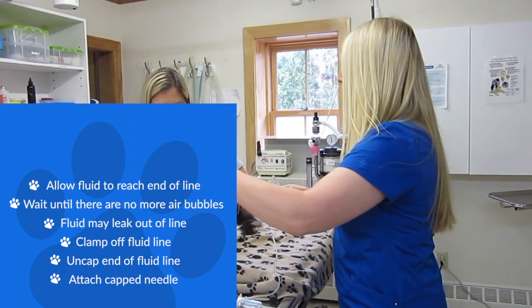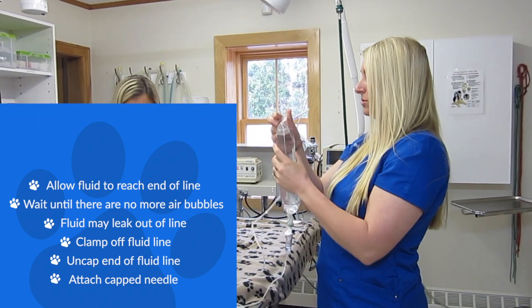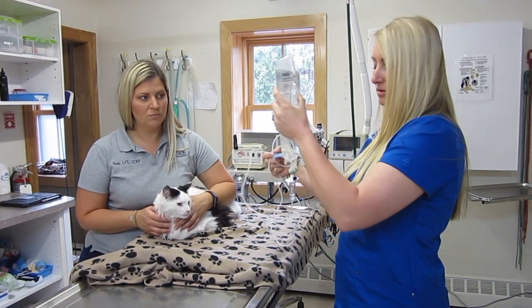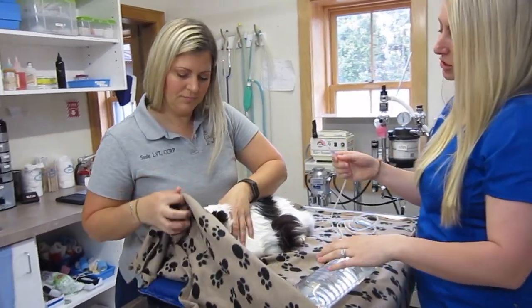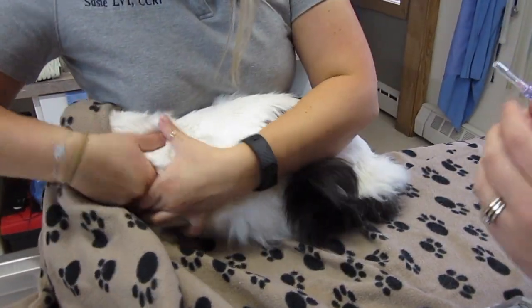Usually what we would use is a fluid pole, or at home if you'd like you can use a hanger and hang it on the cabinet, or if you have two sets of hands to help, you can have one person actually holding the bag. For this instance, I'm going to just hold it myself. And when you are ready to give the fluids, again, if you have a second set of hands just to hold the patient, that's usually what works the best.